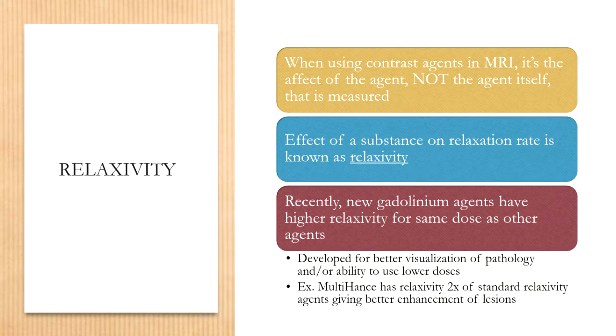And that's where figure 11.3 again comes into play. If you look at page 377 again, we looked at the top picture and the bottom left. Let's look at the middle and the right picture. If you look at the labels, it says axial T1 post GAD double dose, and then axial T1 post-GAD triple dose. What that is, is that they have used gadolinium that is a double dose or a triple dose dosing standard.